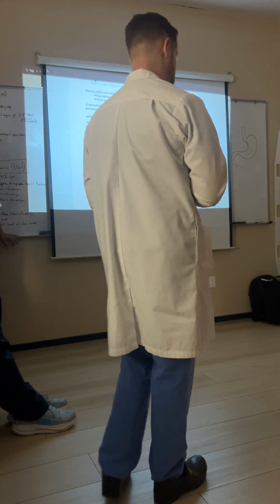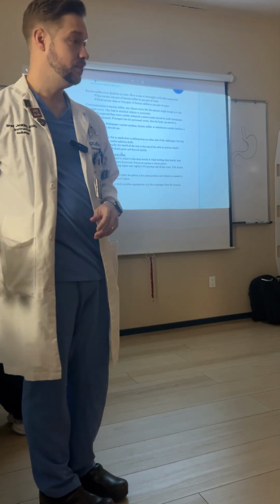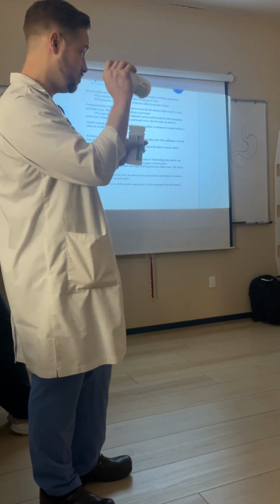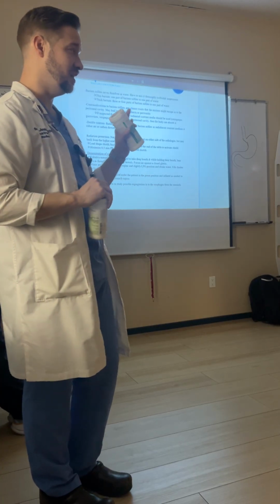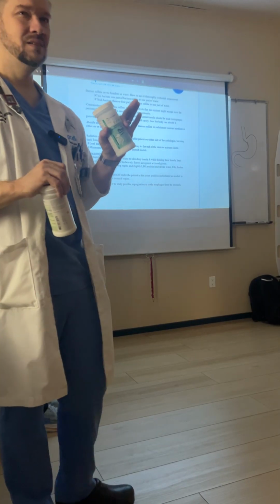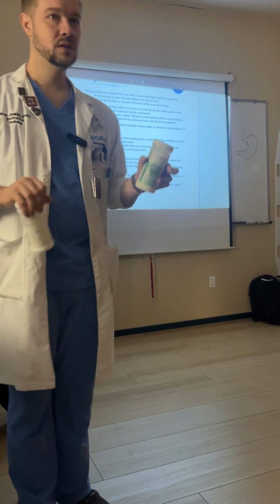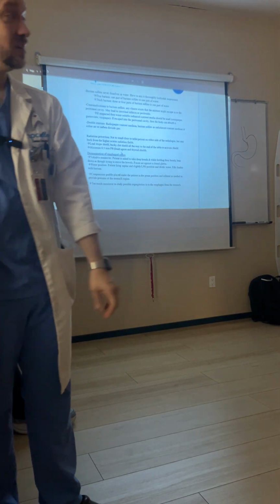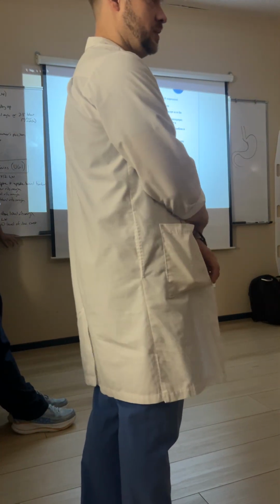Okay? And then for adults? For adults, it depends on the history, but yes, we would either use both of these, and thin barium is going to come through a straw. Thick barium is actually a little difficult to pull through a straw. You can, but it's like pulling through a thick milkshake, you know. Any other questions?